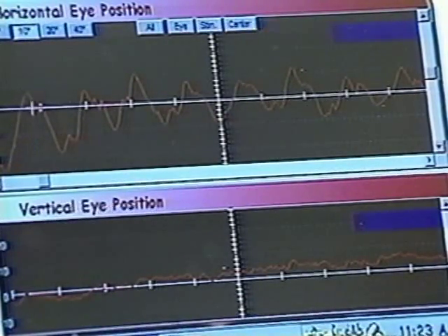Once the normal nystagmus is elicited with the testing modality, the fixation light is then turned on, where we observe a greater than 50% reduction in the degree of the sinusoidal nystagmus. This represents a normal finding and is what is expected to be seen with this testing modality.